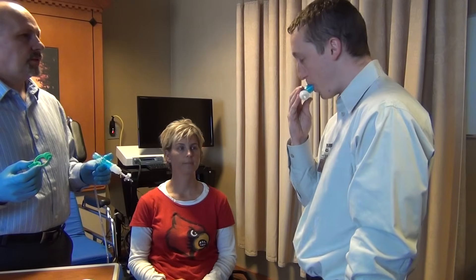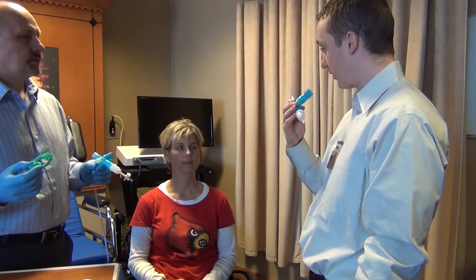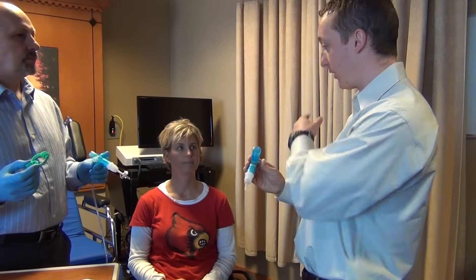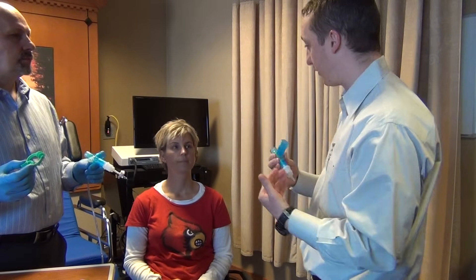Put it in. Then inhale as hard as you can. But first you have to blow out through the mouthpiece. I'm going to listen for no more air so I know that your lungs are empty, and then I'll ask you to breathe in as hard as you can.